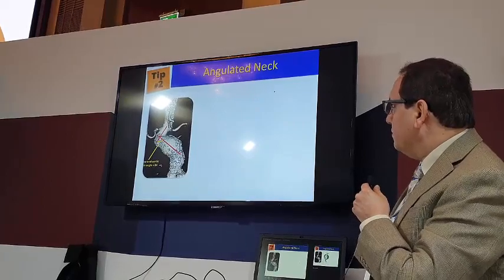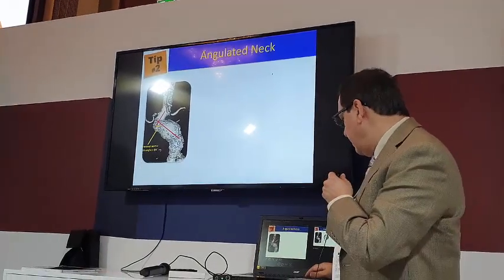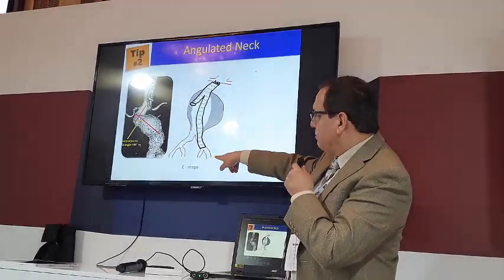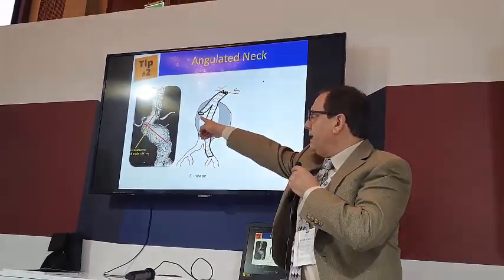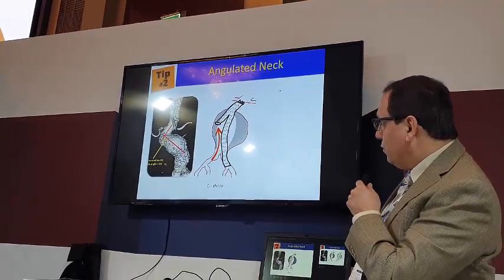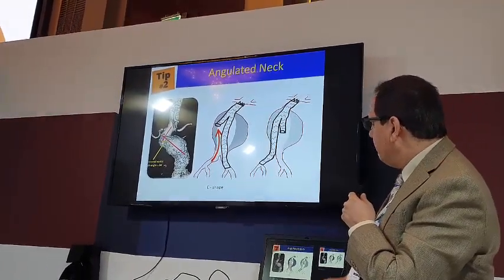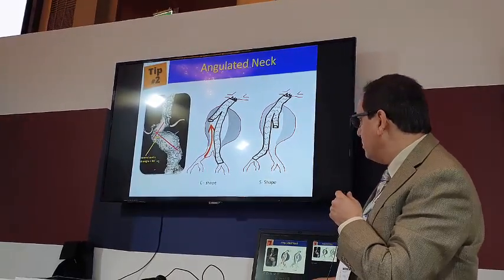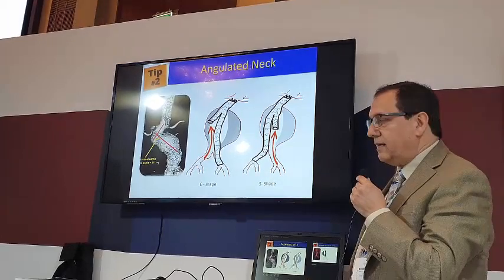Let's go to tip 2. What if you have an angulation like that? If you deploy it in the C shape from the left side, the contralateral limb will be against the thrombus. It will be very hard to cannulate this way. What if you do it this way? If you deploy it in an S shape like that, it will be very easy to cannulate. It will be a straightforward shot. This is the second tip.